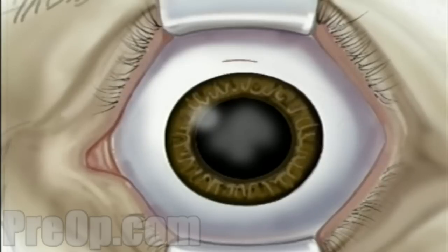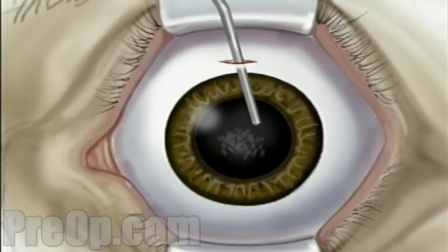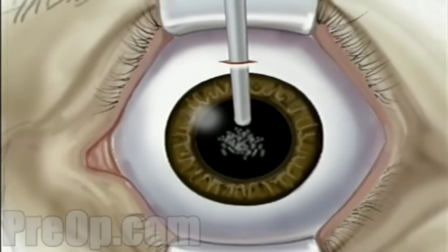When the operative field is numb, the surgeon will use the microscope to help make a very small incision, just three millimeters above the iris. The lens is located just behind the iris, contained in the elastic capsule. Next, the surgeon will open the top of the capsule and remove the lens. Most likely, your doctor will use a small probe which vibrates at a high frequency. The probe vibrations break the old lens into microscopic pieces, which can then be drawn out with gentle suction.